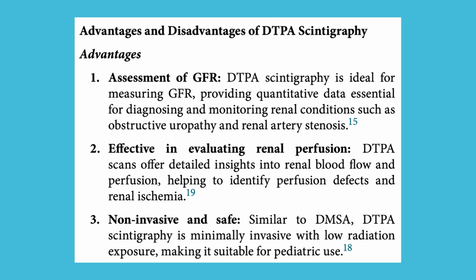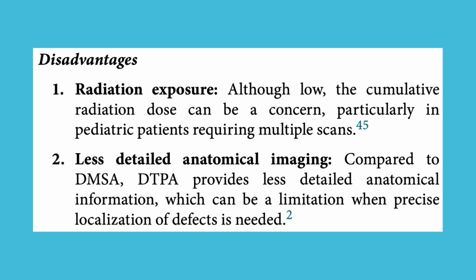2. Effective in evaluating renal perfusion. DTPA scans offer detailed insights into renal blood flow and perfusion, helping to identify perfusion defects and renal ischemia. 3. Non-invasive and safe. Similar to DMSA, DTPA scintigraphy is minimally invasive with low radiation exposure, making it suitable for pediatric use. Disadvantages. 1. Radiation exposure.